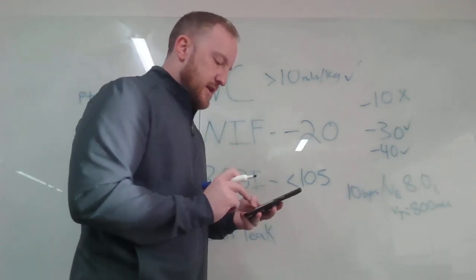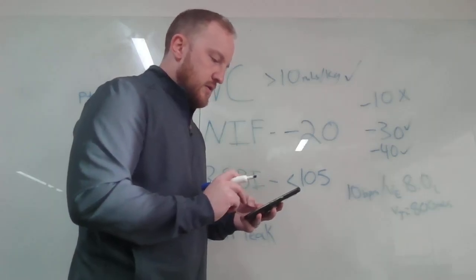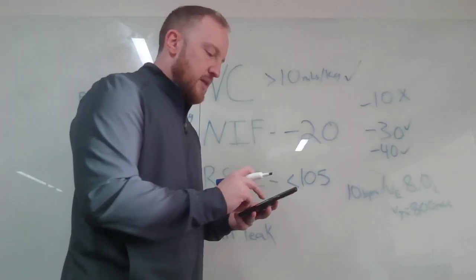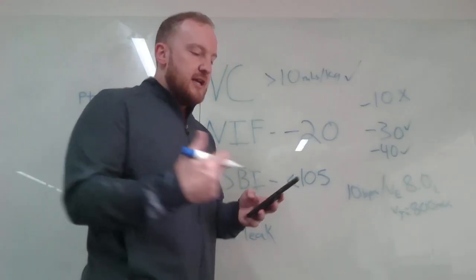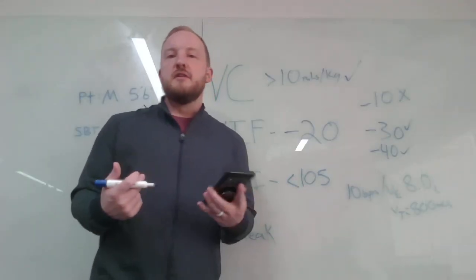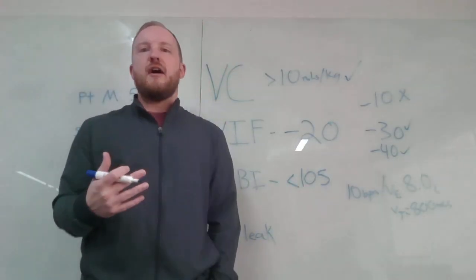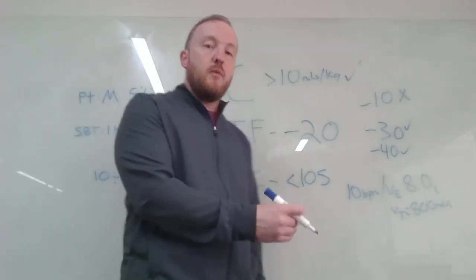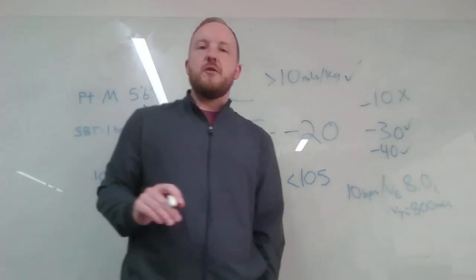I'm sorry, I said 20, right? Breathing 20 times a minute divided by 0.2 for 200 mLs gives me an RSBI of 100, right? So that's a quick, easy way, when you're looking at it and you've forgotten the math, right? If we're breathing at least that much volume with that rate. So here's another one. Patient breathing 24 times a minute.